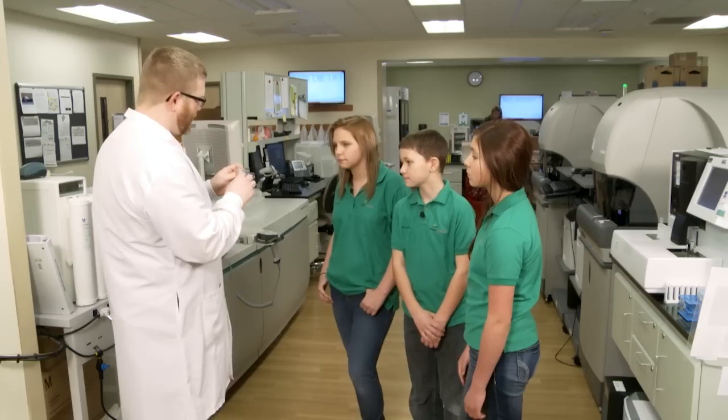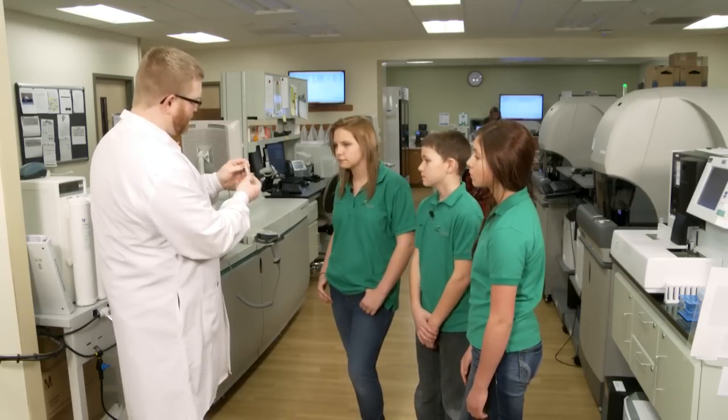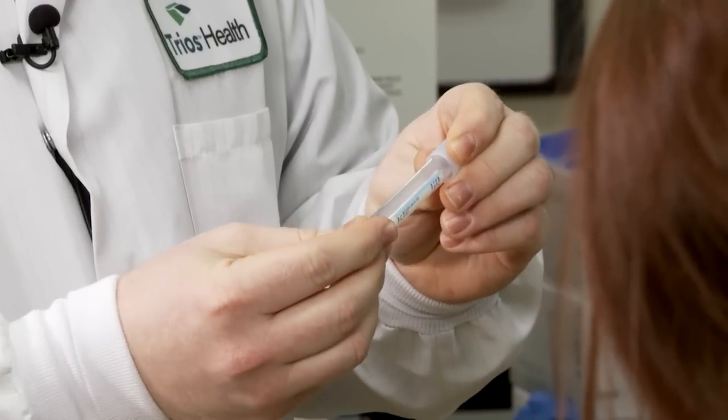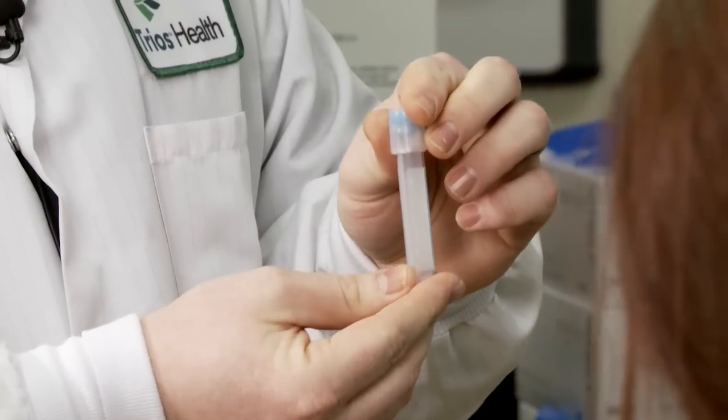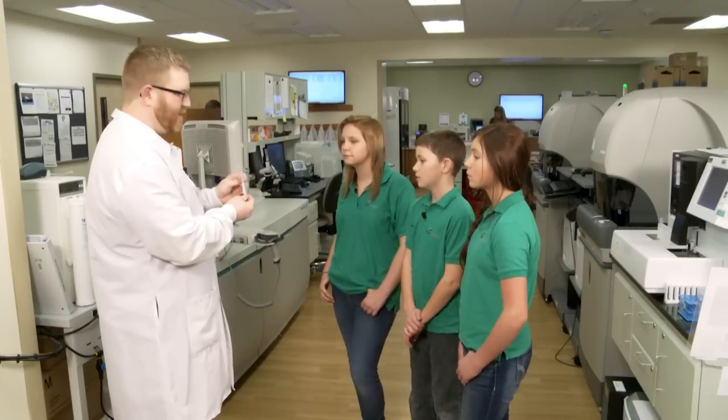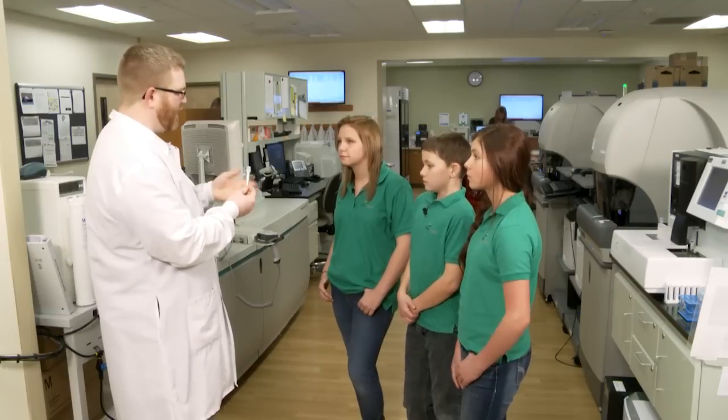In a tube like this, the gel can interfere. You can see there's a little bit of liquid down in there — we don't want the gel to interfere with what's going on inside the tube. So we have to be very careful that we don't drop the tube or shake it after we've centrifuged it, so that we don't mix it back up again.